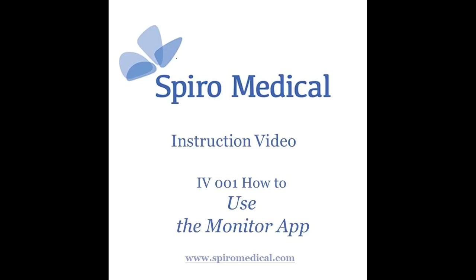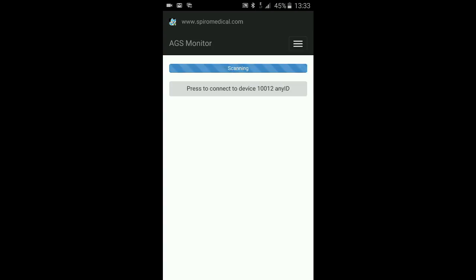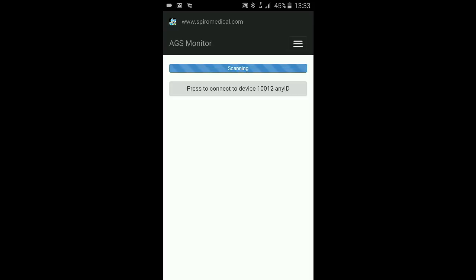It's serial number 10012 with a recording ID of any ID. This could be any ID that is entered during the setup application. I click on it to connect.